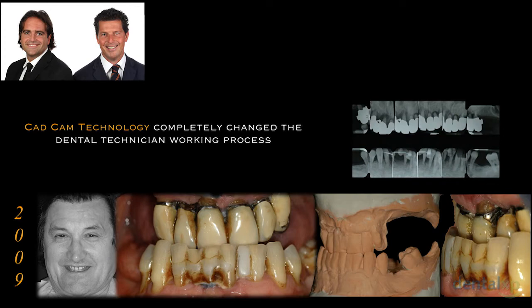Specifically, a full implant arch zirconia rehabilitation on the upper and a full arch zirconia restoration on natural dentition in the lower jaw were planned. But how did new technologies help the dental team in this case?